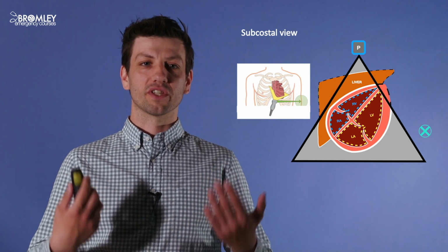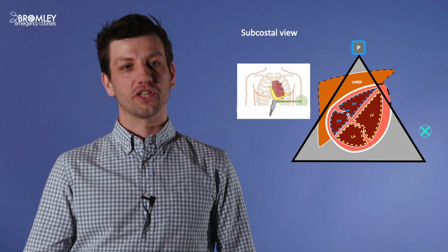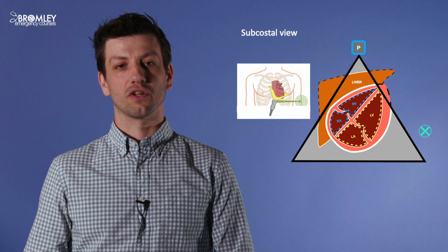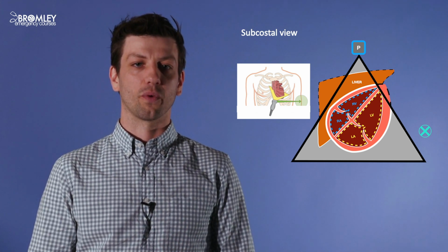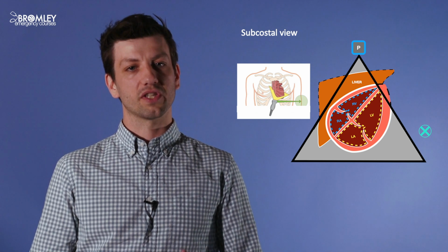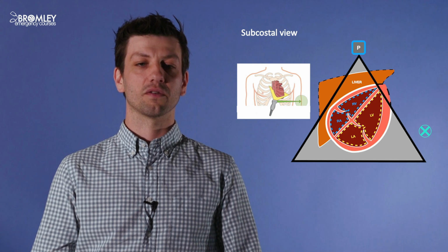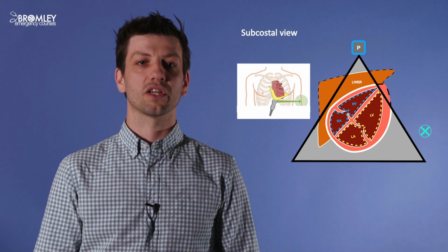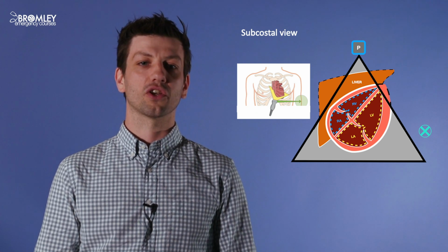So moving on to what you'll see in the subcostal view. You've got your probe positioned in the subxiphoid space, slightly to the patient's right hand side, so that you're using the liver as an acoustic window. Closest to the top of the image is the right side of the heart, and deeper in the image you'll see the left side of the heart. You should be able to identify almost all of the pericardial space.